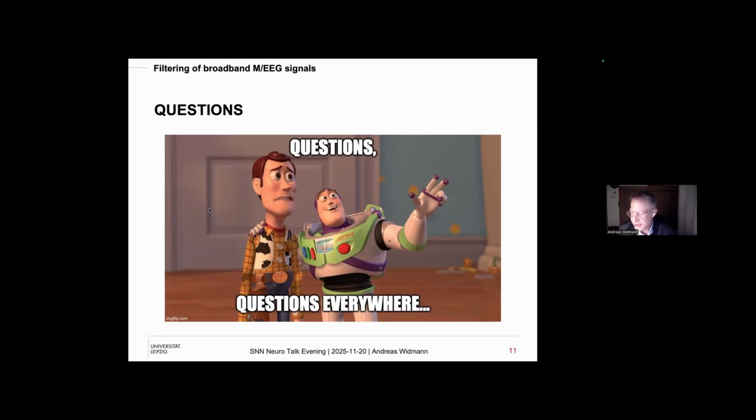Also, sometimes there are alternatives like demeaning and detrending, which can be used much more safely. Even detrending with more complex, quadratic or other trends, which are problematic to describe in filtering math because they are in fact leaky filters. But typically, you basically have to apply common sense. We have an example where you change the properties of your dependent variable by high pass filtering, but if you have breathing or other kinds of noise which you have to remove to look at your signal, you have to do that.